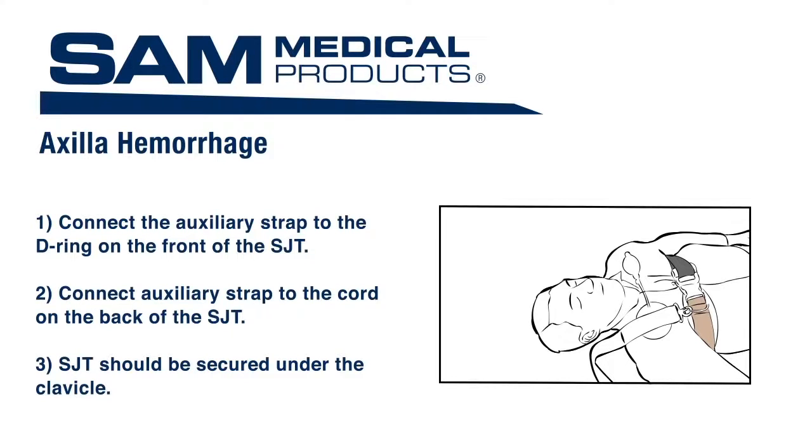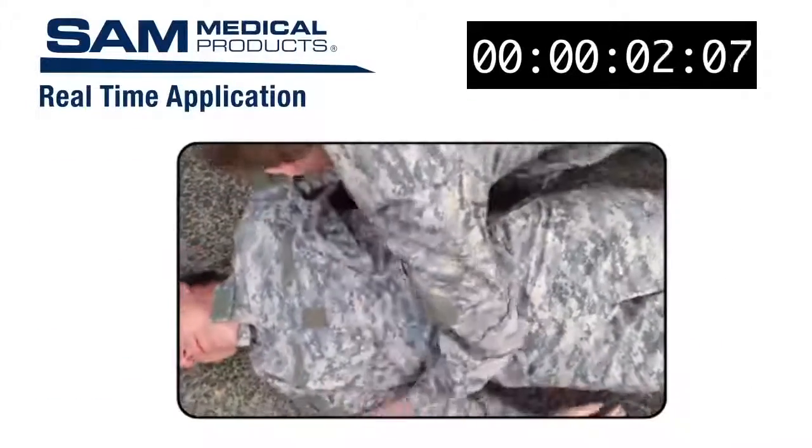Use the hand pump to inflate the TCD until hemorrhage stops. Additional hand pumps may be necessary with changes in altitude. Now let's show a real-time application without interruption.